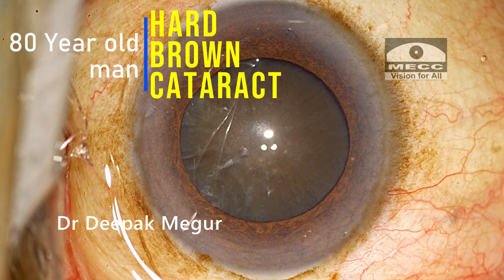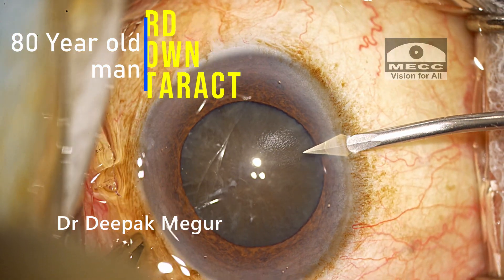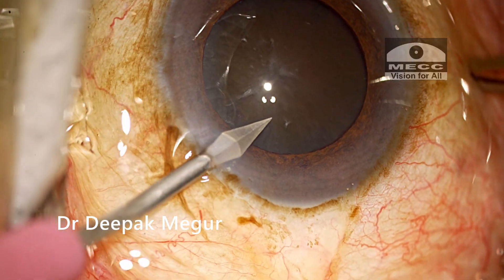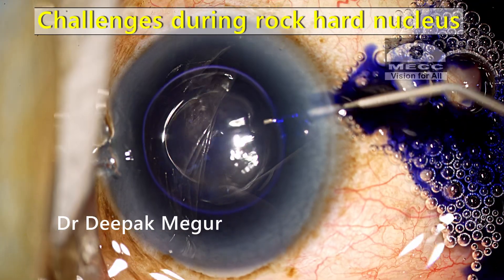We have this 80-year-old gentleman with a brown, very dense cataract. Let's understand and discuss a few issues which we face while managing such a nucleus — these are the expected challenges while managing such a rock-hard nucleus.